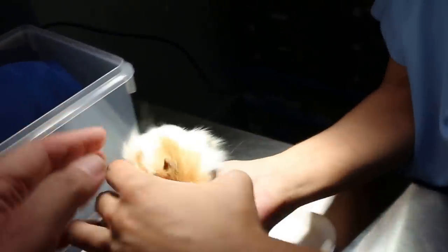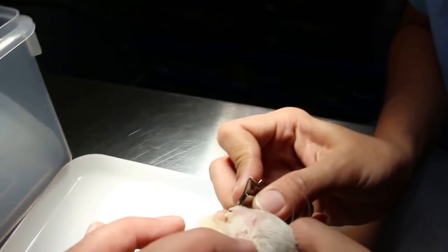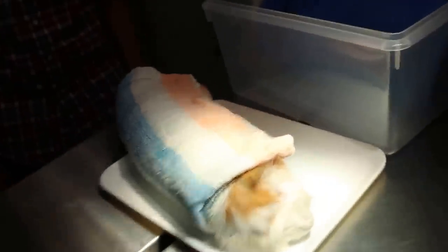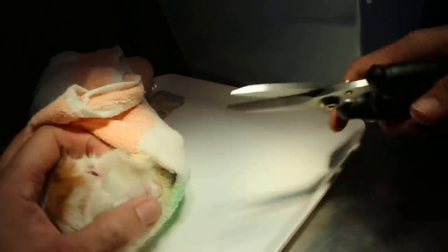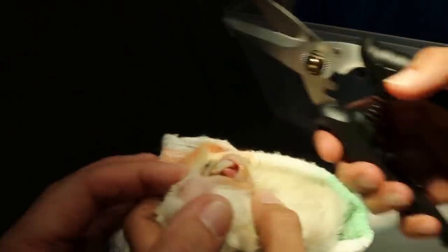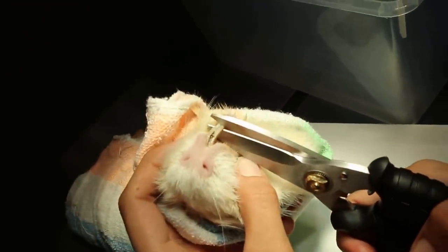You go to the side, okay. For the — just clipping off. Actually, we don't need someone to hold that; you just hold the mouth open. So where's the cutter? There are two ways: one, you just cut, okay, just cut — just show, just cut like that. Okay, don't cut now, just show me. That's one method.